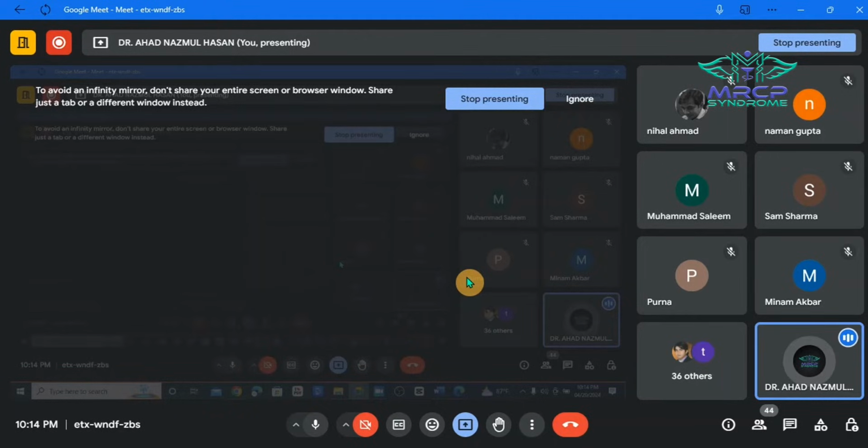Then we can also go in case of infection like cerebral abscess, or if there is any inflammation like cerebritis or encephalitis or meningitis. Then some of the inflammatory or demyelinating conditions like multiple sclerosis or sarcoidosis. And you need to remember one thing very clearly: the CT scan does not detect demyelination. So in any demyelinating condition, you should go for the MRI.